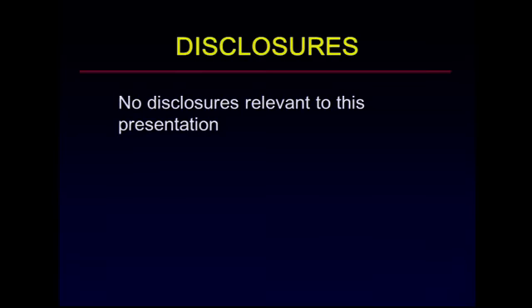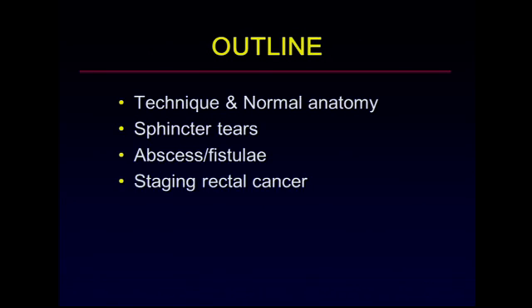And today we're going to talk about ultrasound evaluation of the anal sphincter. I have no disclosures that are relevant to this particular presentation. My objectives are to discuss first the technique and normal anatomy of the anal sphincter, and then I'm going to concentrate on talking about ultrasound evaluation of tears of the anal sphincter.